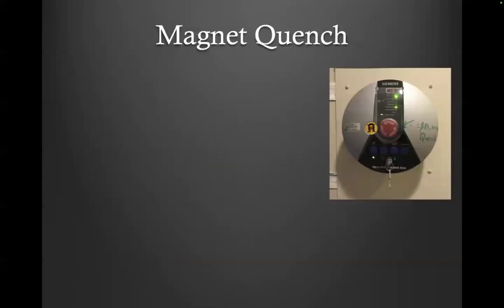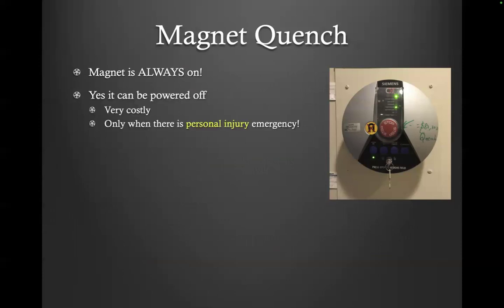Okay. Now we move on to something that rarely happens, but you should still know. I already said that the magnet is always on, but it can be powered off. It's very costly and it should be done seriously and only when there are personnel injury emergencies. This is called magnet quench.